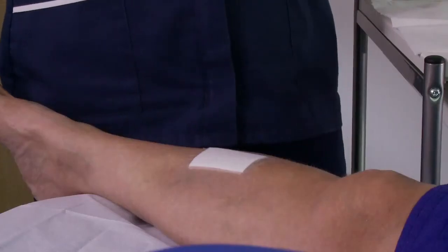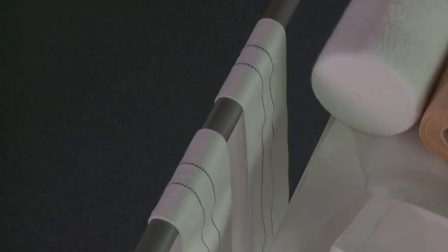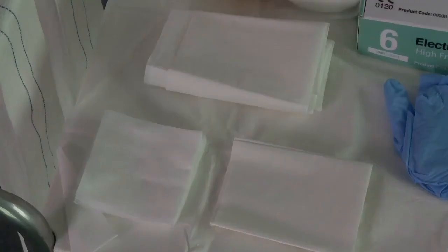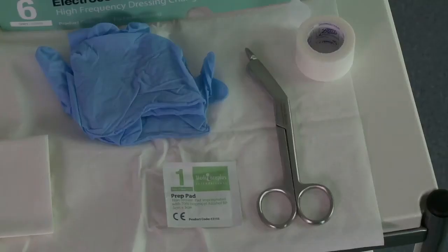Our process starts once the primary dressing has been applied to the wound. Make sure you have everything you need ready and to hand to ensure an efficient dressing change experience for your patient without any unnecessary delays or distress.